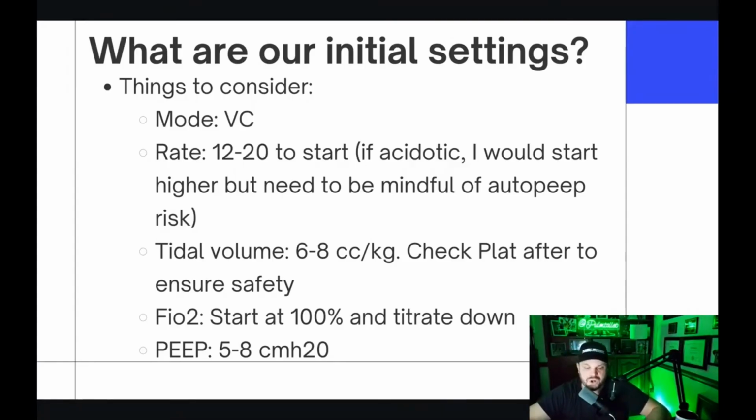I could start at 7, and we're going to have to work my way down. But the initial settings, we go somewhere between 6 and 8. I usually go about 7. That should still be ideal body weight.